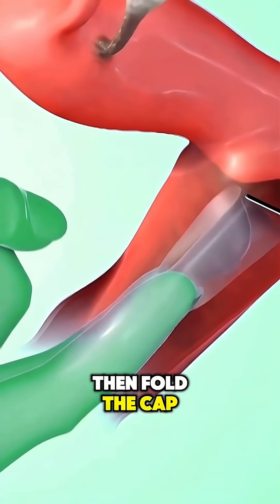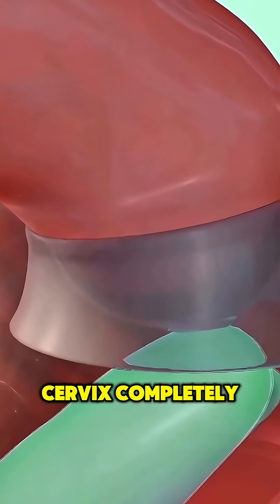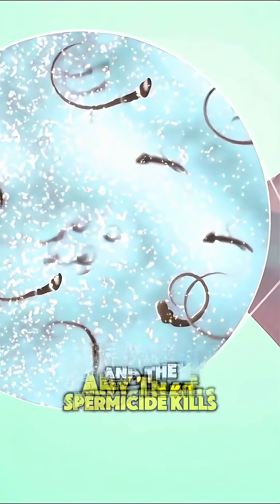Then fold the cap and gently push it deep into the vagina until it covers the cervix completely. It works by blocking sperm from entering the uterus, and the spermicide kills any that come near.